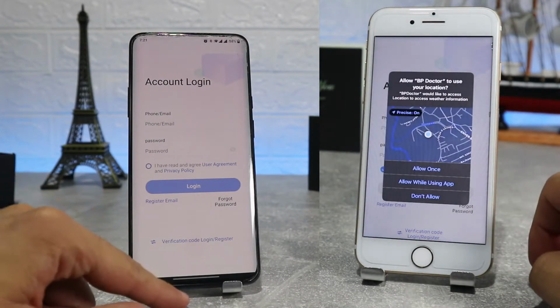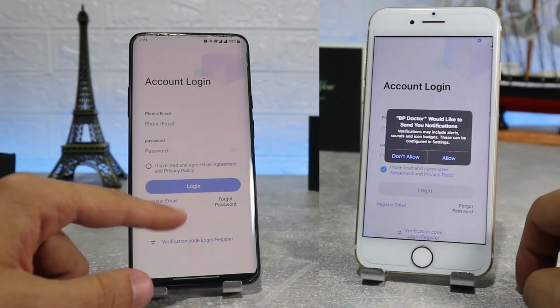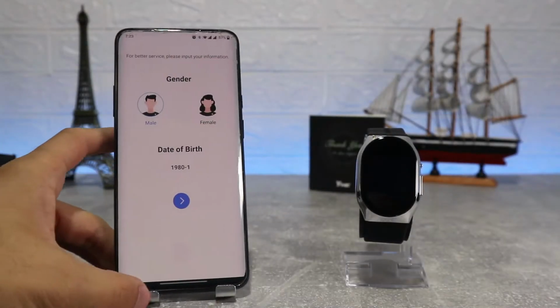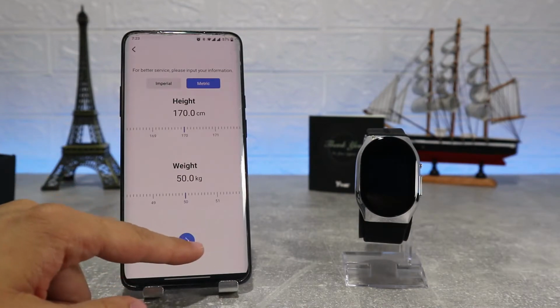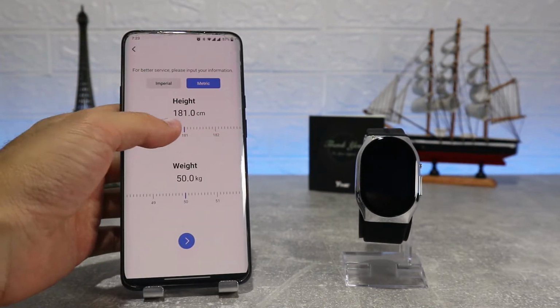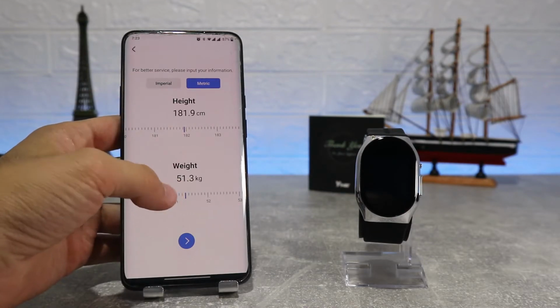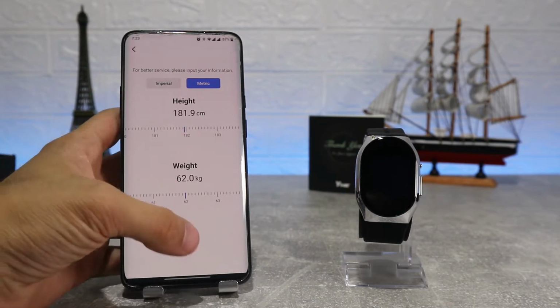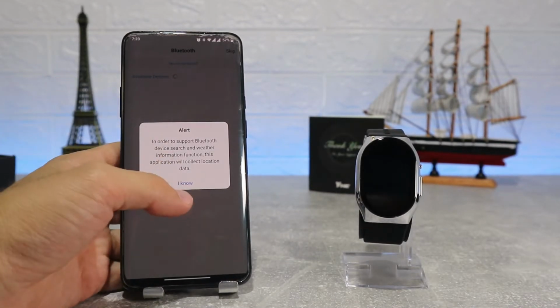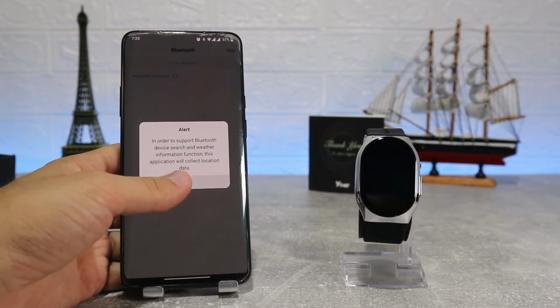After we open the app, we will accept the terms and conditions and we have to log in with an account. Before we try to connect, you should also turn on your Wi-Fi, Bluetooth, and your GPS so you can do this process easier. Now, we will set some personal data such as gender, date of birth, height, and weight. Also here we have allowed BP Doctor Plus to access on-device location.